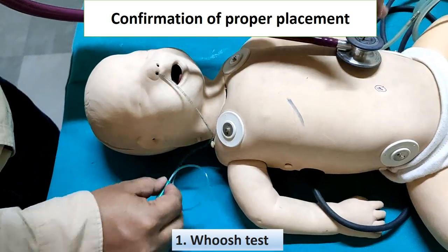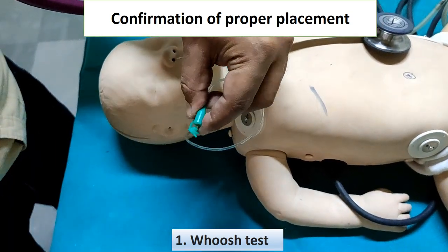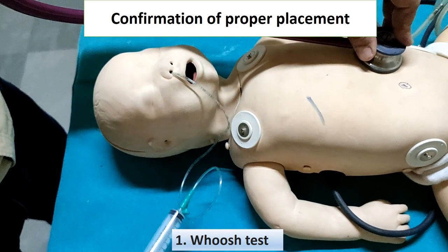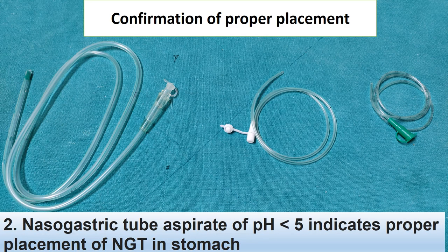There are various methods to confirm proper placement of the NG tube. One method is the whoosh test: inject air by a syringe and auscultate over the epigastric region. If a gurgling sound is audible, air is entering the stomach and the NG is in proper place; if not, the tip is elsewhere. Another method is to check the pH of gastric aspirate — if it is less than 5, it indicates the NG is in the stomach.